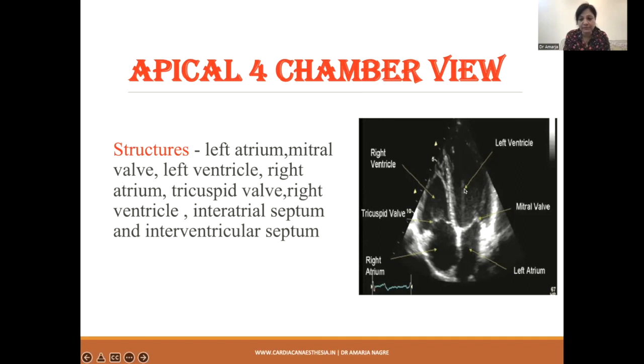If the patient has pulmonary hypertension or cardiomyopathies, this may not be the condition. That is why we have to know how we identify the chambers. So the largest, globular, apex-forming ventricle is usually the left ventricle. Okay, the other ventricle, which is usually smaller and triangular, and which normally does not form the apex, is the right ventricle.